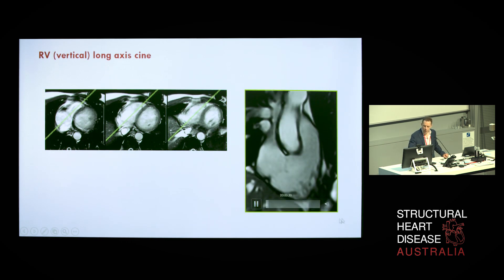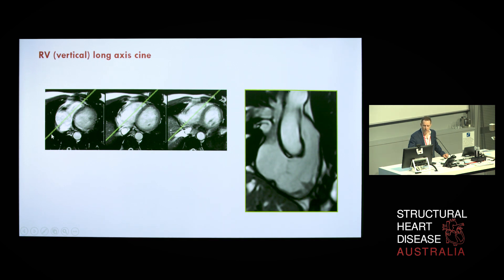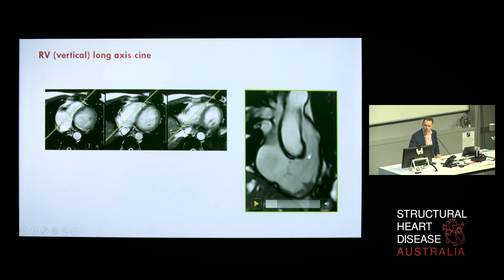From an axial set of slices, we take an oblique sagittal image that passes through the midpoint of the tricuspid valve approximately through the right ventricular apex. Appreciating that the RV apex, even in normal individuals, will wrap around the LV, it's difficult to achieve a plane passing through the true apex — so in this view it will be foreshortened. But you can immediately appreciate the anatomy that defines the right ventricle in terms of its inflow and outflow.